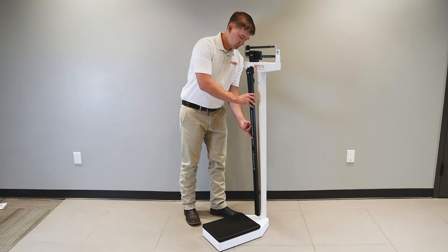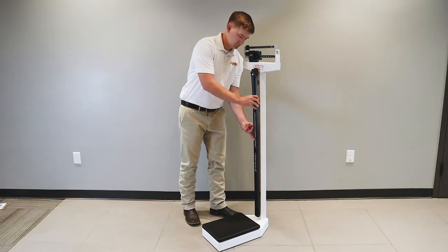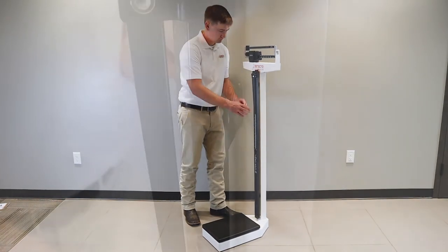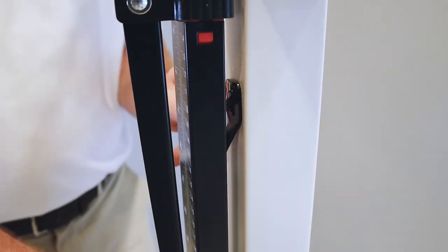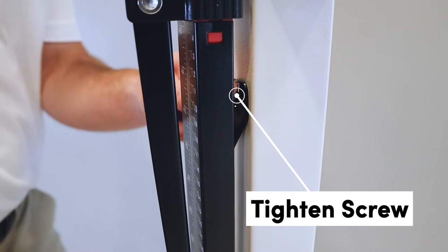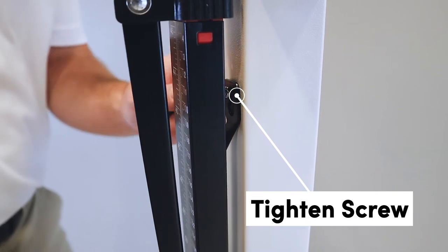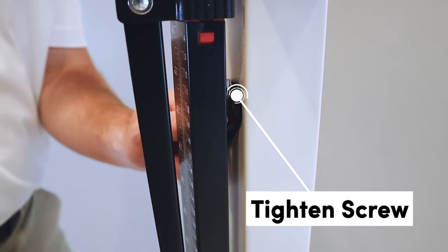The included height rod can be attached by simply placing the slotted holes of both brackets on the back of the height rod over the two hex head screws on the front of the column and pulling down. Use the included wrench to tighten the screws, being careful not to over tighten them.